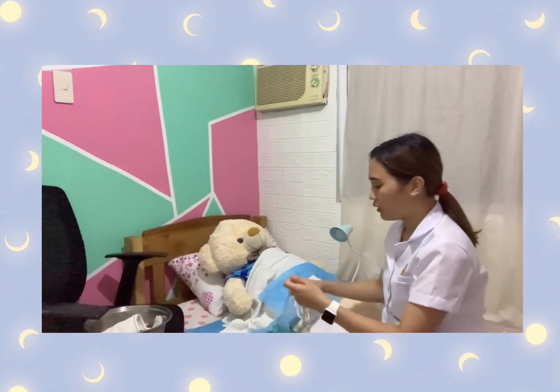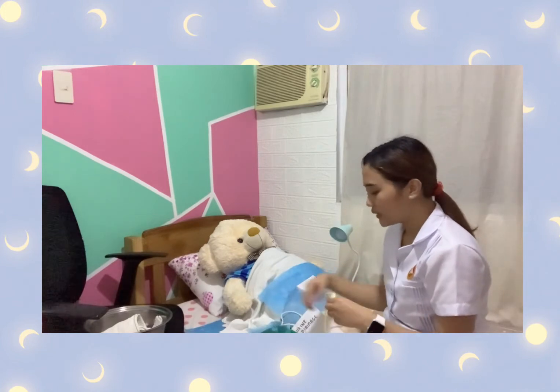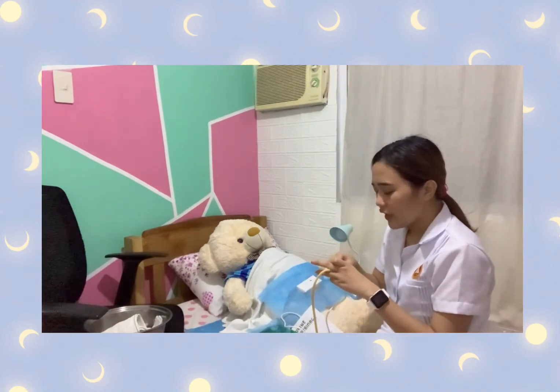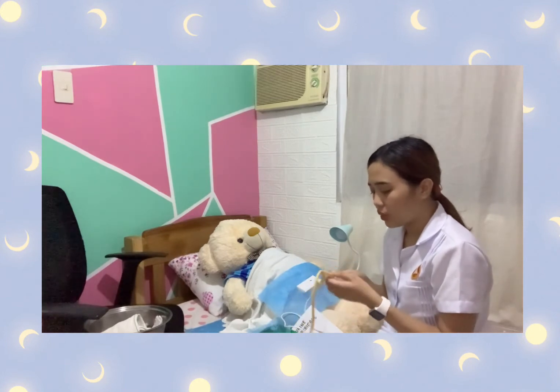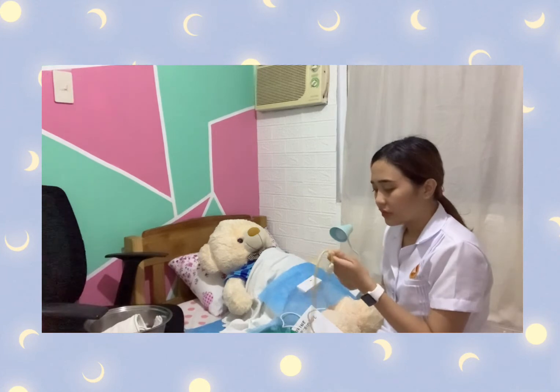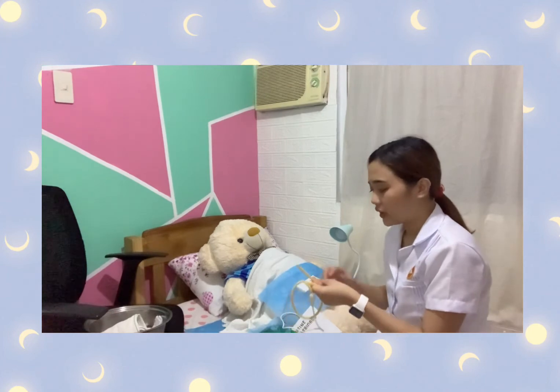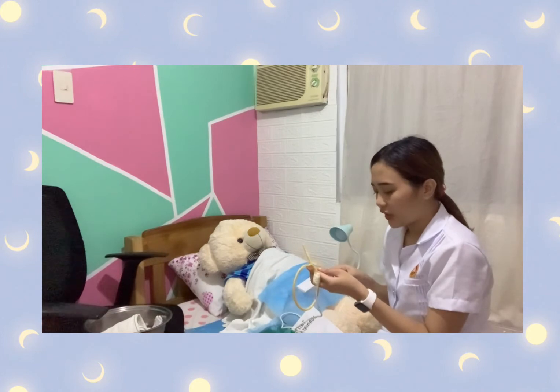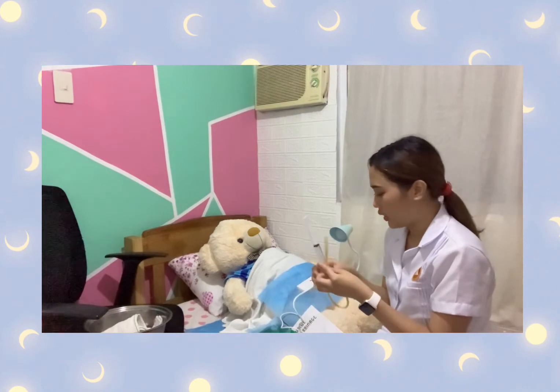So, assume that we've already opened the Foley catheter. We will now test the balloon. We are using an indwelling catheter, so we will insert a pre-filled syringe on the injection part of the catheter, and then insert the appropriate amount of water. When the balloon inflates, so assume that the balloon already inflates, we will now withdraw the water and leave the attached syringe on the injection port.